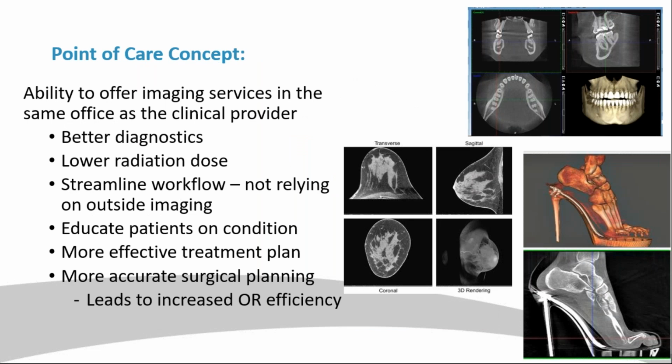So we've kind of all touched on this, but I thought I would really try to give more of the medical perspective on this point of care concept and just what this means more now than ever to everyone in terms of efficiencies and making one trip to the doctor's office in the current COVID-19 environment. But really just wanted to highlight some of the images. So at the top here, some dental, in the mid region here, that's a breast exam. And then here, there's actually a foot here and a high heel to give you the level of detail that some of these systems can accomplish.